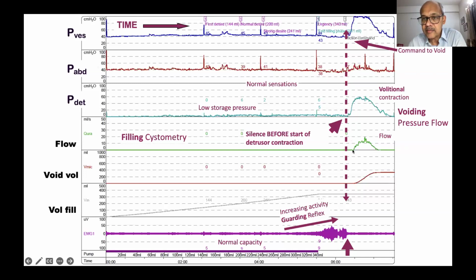So there'll be a delay, a time lag between the start of the detrusor contraction and the onset of flow. And then the detrusor pressure takes a peak, typically an eccentric, bell-shaped curve, and you get urine flow out freely. A normal flow is characterized by urine coming out in the normal time, at a normal rate, and the bladder should empty completely.